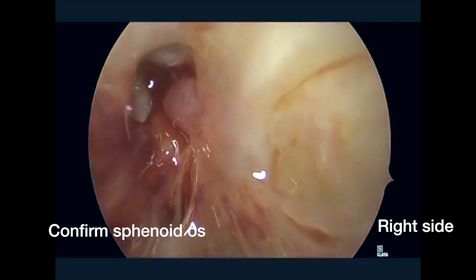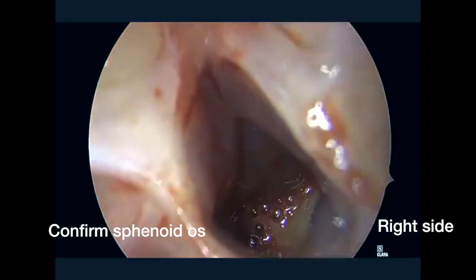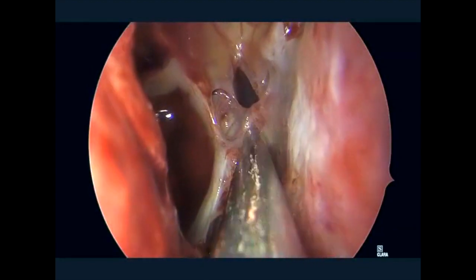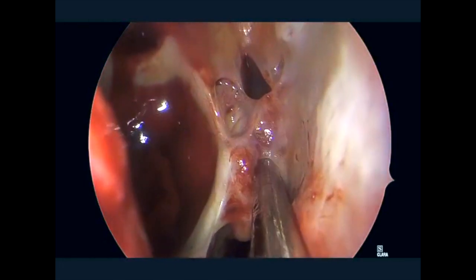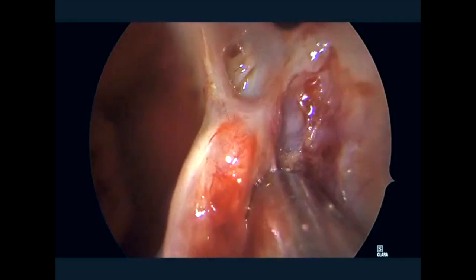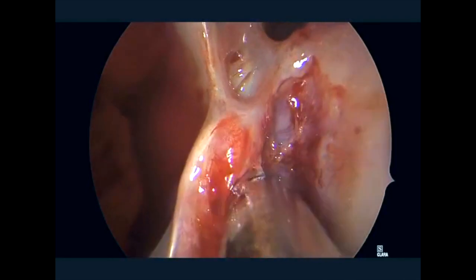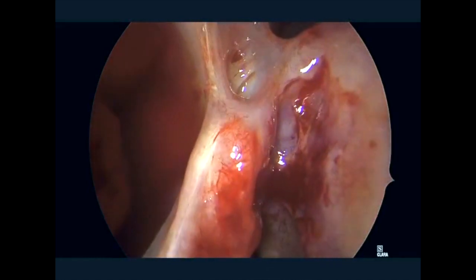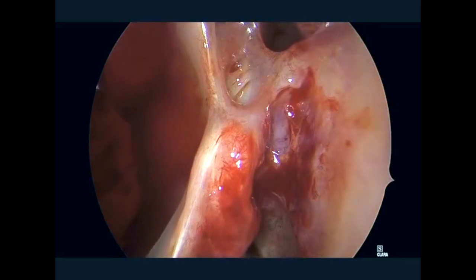Here you see a zero-degree endoscope in the right nasal cavity. This is the prior sphenoid opening demonstrated on the right side, with an open maxillary antrostomy, and you can see scarring inferiorly along the sphenoid face as well as superiorly. We started by revising some of the scar around the opening in order to better identify the pedicle of the posterior septal artery.